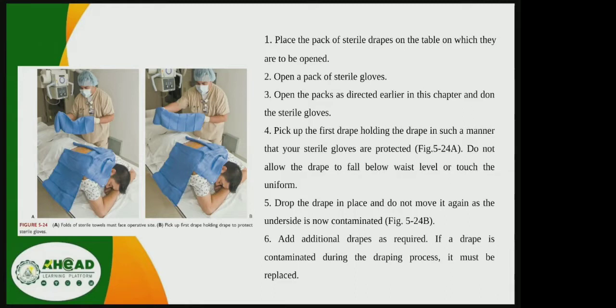Figure 5-24. Letter A. Folds of sterile towel must face operative site. Letter B. Pick up first drape, holding drape to protect gloves.